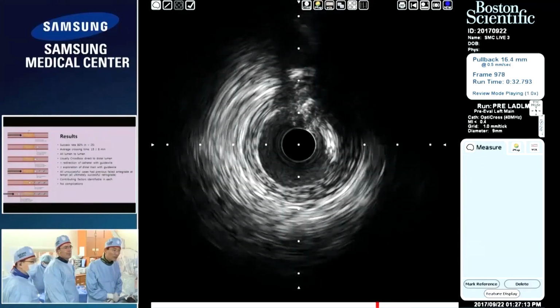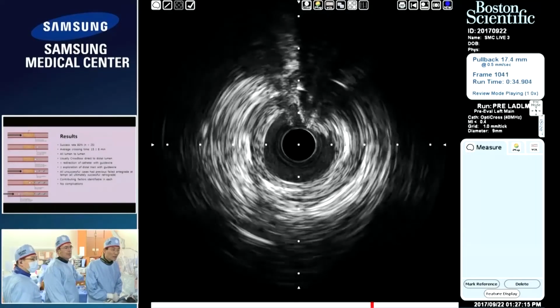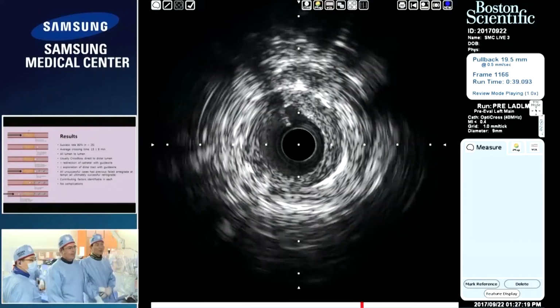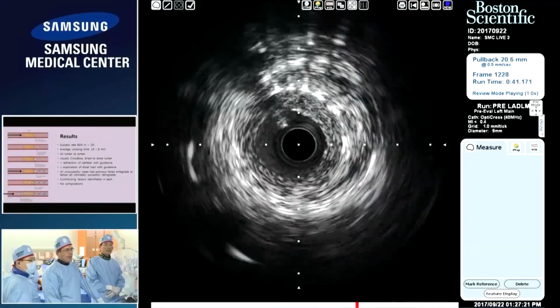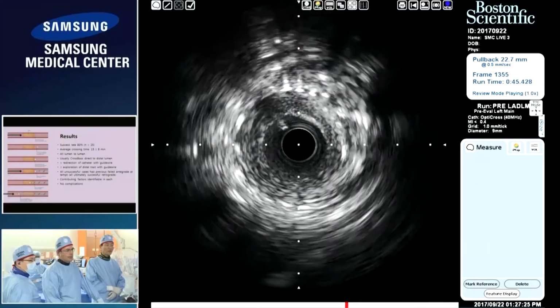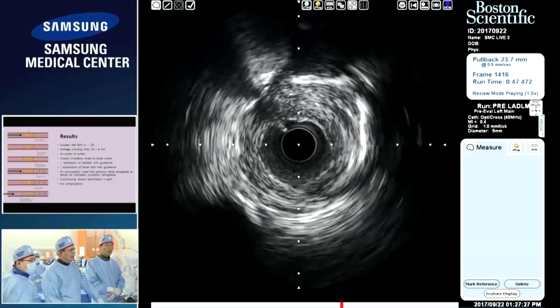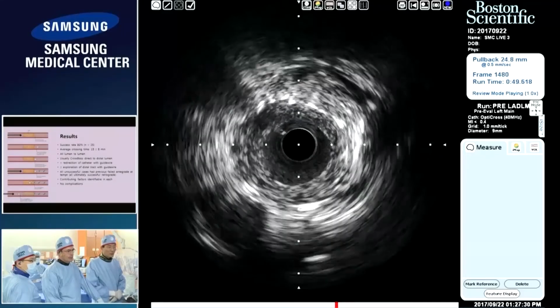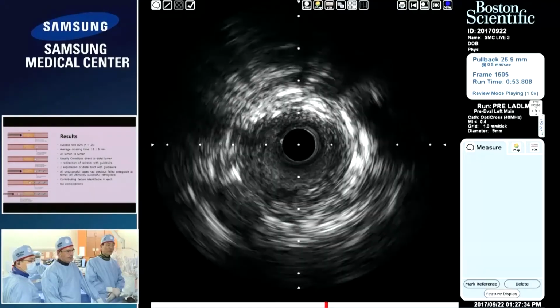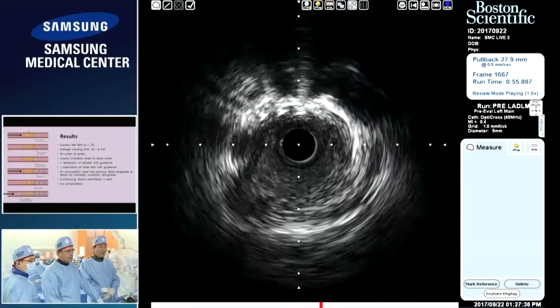This is calcification, distal to the stent. Okay, this is the stent coming. So plaque is diffusely covering over the stent. So we need some consideration of this distribution. And there is a huge amount of plaque, even in the 2 millimeter lumen distal of the stent.